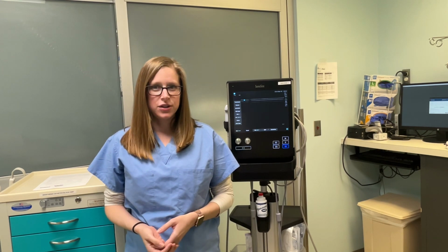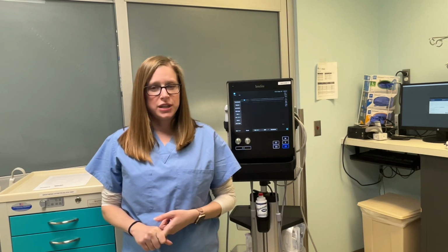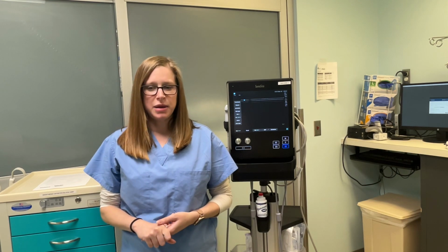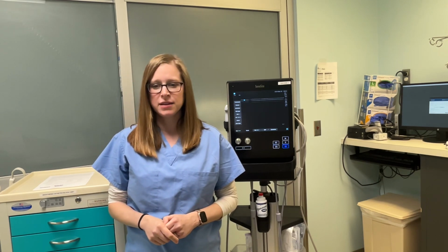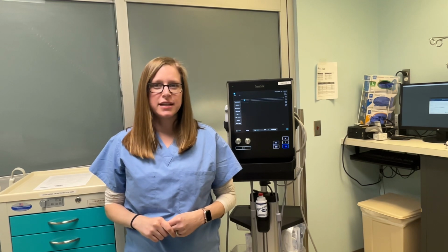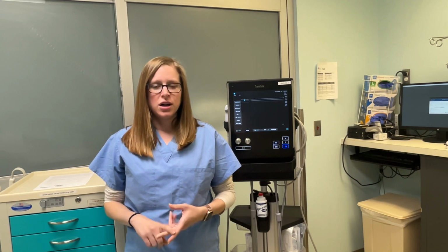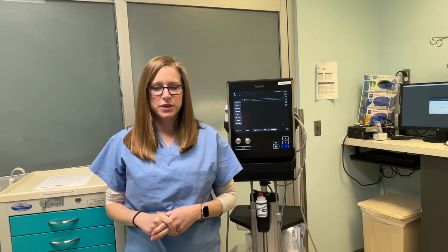On arrival to PACU, notify the doctor that the patient is here. Follow the tip sheet for documentation and checking in the patient. If you need any help with this, you can use the F1 function in Epic. Also, the patient should be hooked up to the monitor with the blood pressure cuff cycling every 5 minutes. Oxygen should be placed on the patient at 2 liters nasal cannula and starting the IV fluids.